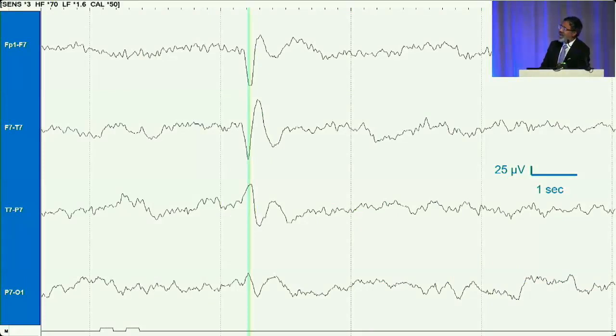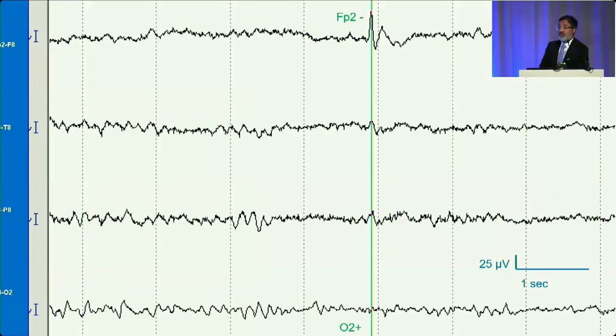Now, if you have no phase reversal in a bipolar montage, here's this deflection where there's only an upward deflection. The rules state that the maximum negativity or positivity are at the ends of the chain. Again, we have to make an assumption of knowing what the polarity is. If I tell you the polarity is negative, the maximum here is FP2.